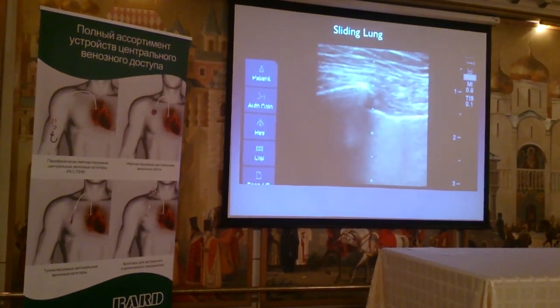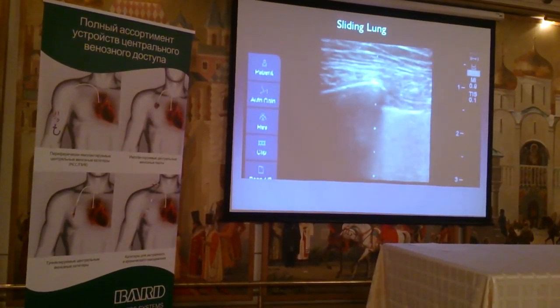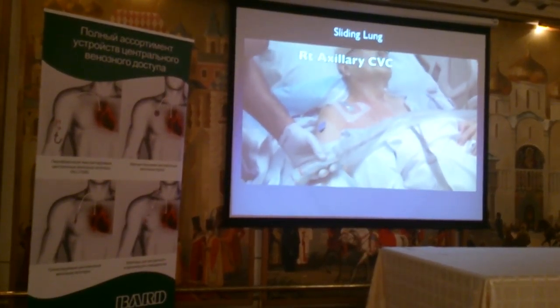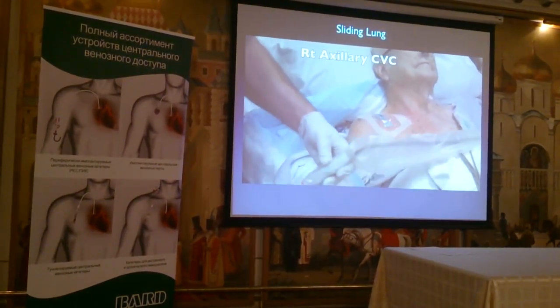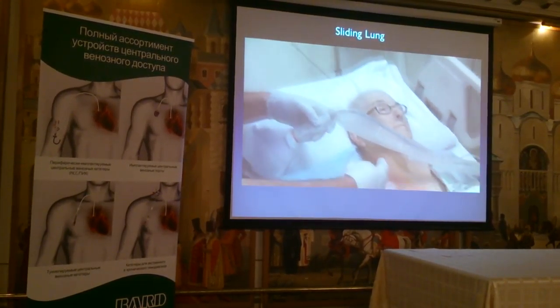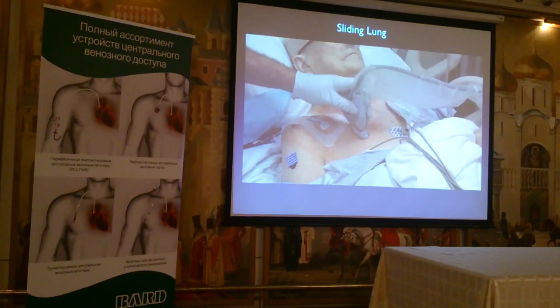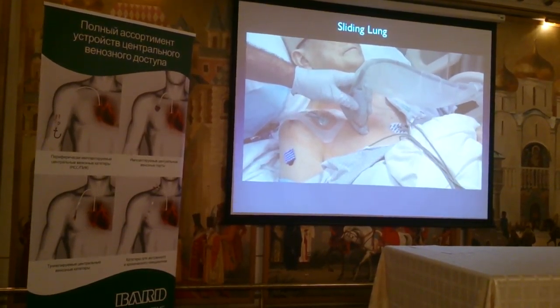We're going to repeat this after the procedure. As you'll see, this patient had a venous catheter placed, and we're going to make sure that her lung sliding sign hasn't changed. We're going to put the probe in the area parallel to the sternum, just to the right of the sternum, and see if we have lung sliding.